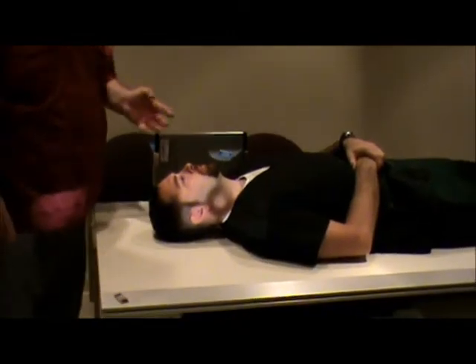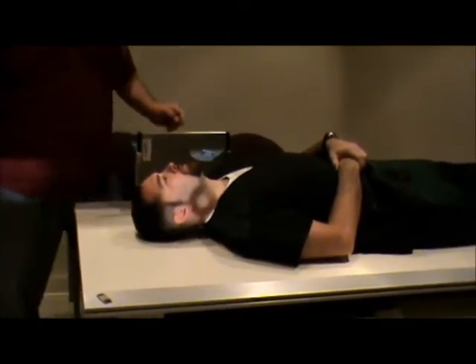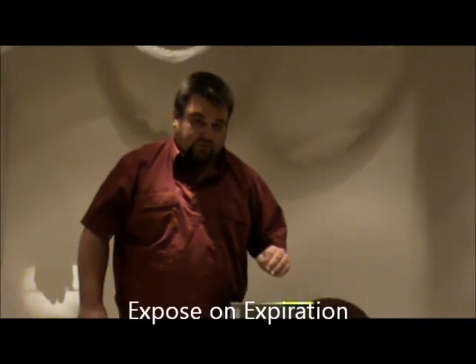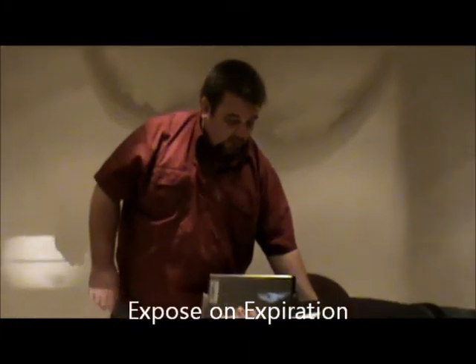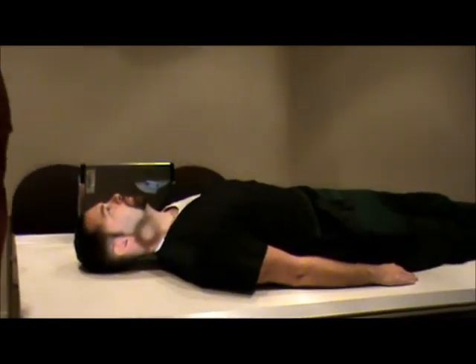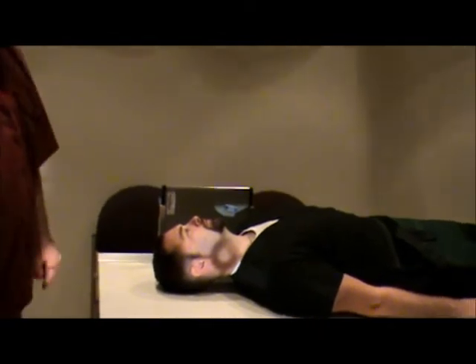We're going to have the patient put their arm by their side. We can actually give the patient a sheet that they can hold in each hand, wrap it around their feet, and then they can pull down on the sheet so they can relax their shoulders down. You're going to expose this on expiration so we can get the shoulders as relaxed as possible. The patient relaxes their shoulders down, we verify our centering is correct, and then we go ahead and make our exposure.